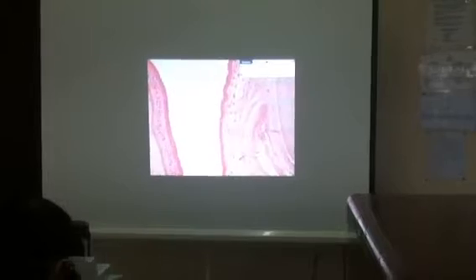That you should be familiar with in this slide is the epithelium. Now, the respiratory passages and the conducting portion of the respiratory tract is lined by what type of epithelium? Pseudostratified columnar. Okay, pseudostratified ciliated columnar epithelium. So, that is the appearance of the pseudostratified ciliated columnar epithelium.